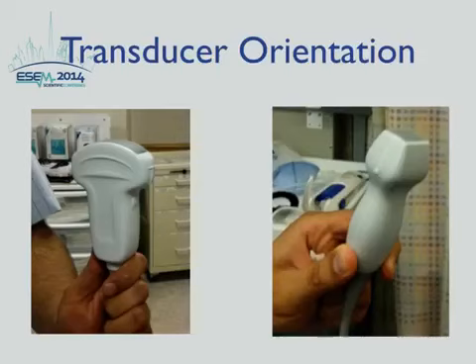When discussing the different probes, you will see when we go through all of the ultrasound applications, it's very important to understand the transducer orientation. And the transducer orientation depends on the probe marker. You'll see in this machine, the phased array probe as well as the curved probe have a specific probe marker that will help you understand the orientation of the image.